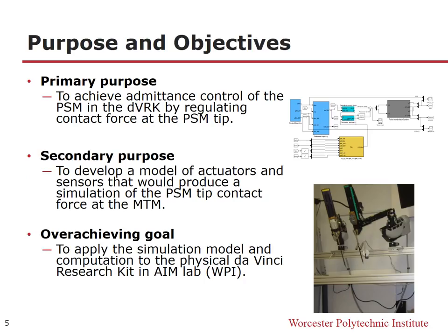Thanks, Aman. Many tasks performed by a robot manipulator require the robot to interact with its environment, and it necessitates that a robot realize its predisposed position. Additionally, the robot manipulator either needs to overcome the resistance from the environment or comply with the environment. Hence, admittance control is used for compliant motion control. For this project, we have two purposes.